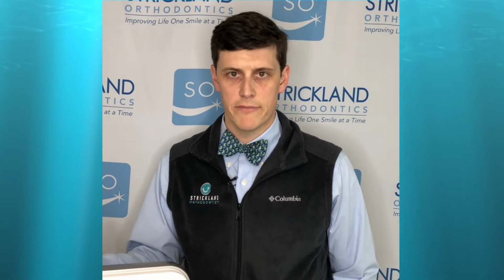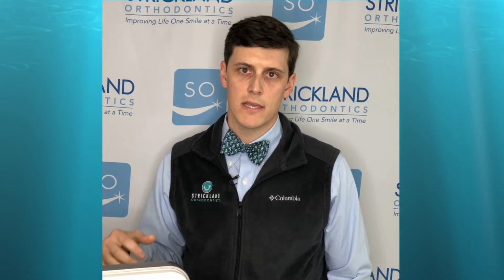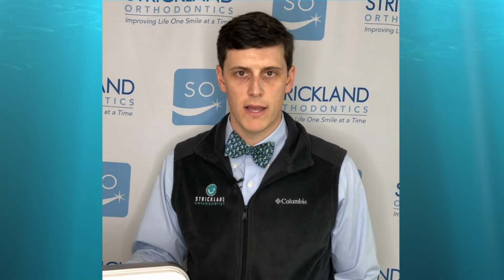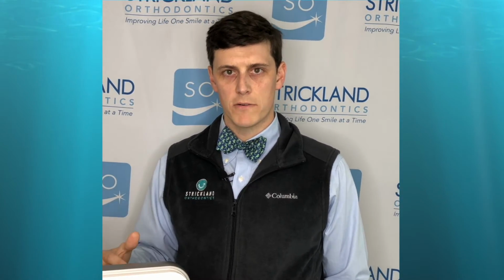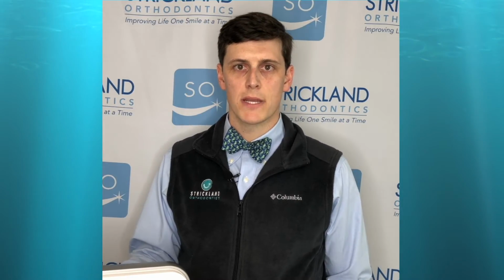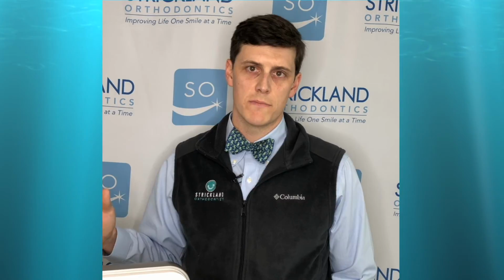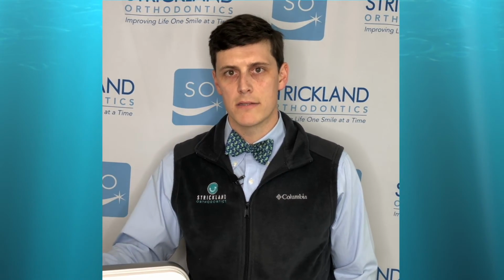So as you can see, just accepting a plan that is developed by the AI and the technicians, while it's a good starting place, you really need to make sure that you find an expert who is really comfortable moving teeth with plastic, and has the experience and expertise to make sure that you can still get the same outcome that you're wanting to receive, no matter if it's with braces or any of the clear aligner systems.